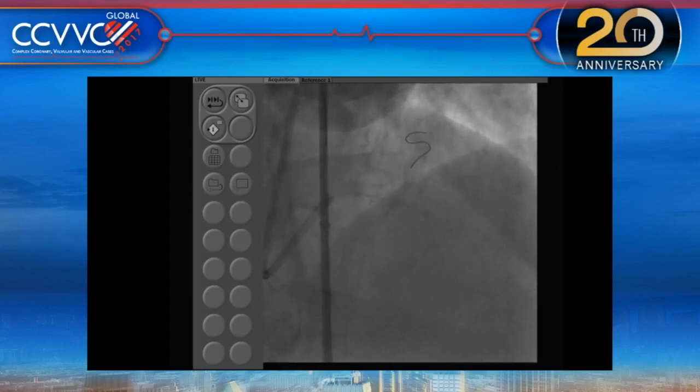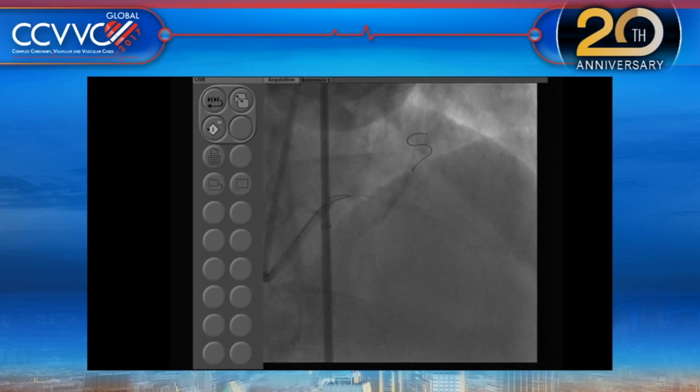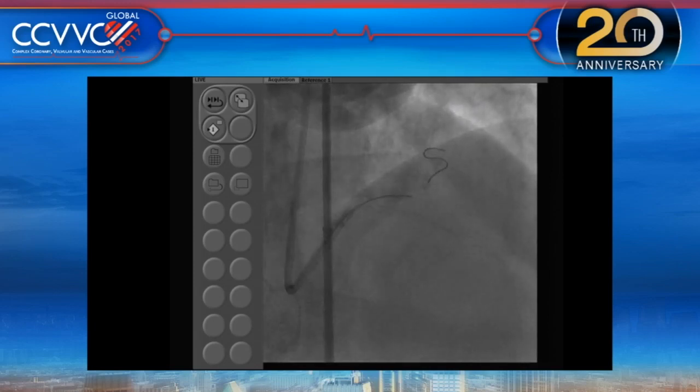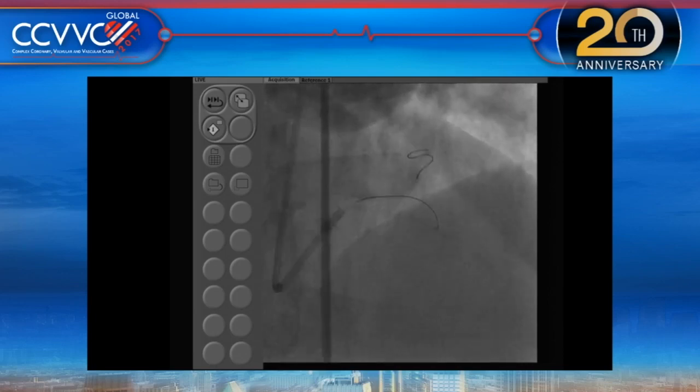So nothing wrong in this case if you want to just do a balloon, let's say a Flextome 3.5, and see if you have expansion at the level of the distal left main to the LAD, maybe avoiding the rotablation of the LAD. And if you cannot expand it, then clearly open up the ostial circ anyway. And you want to go to another view?